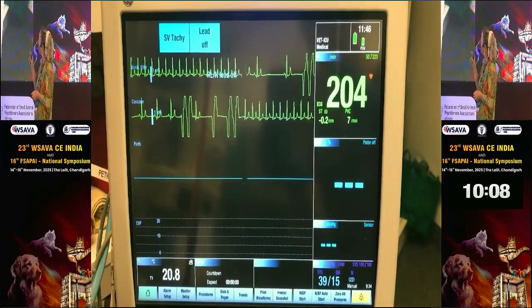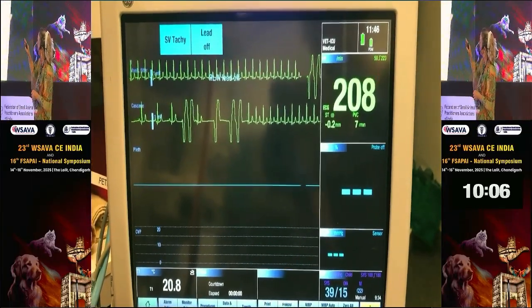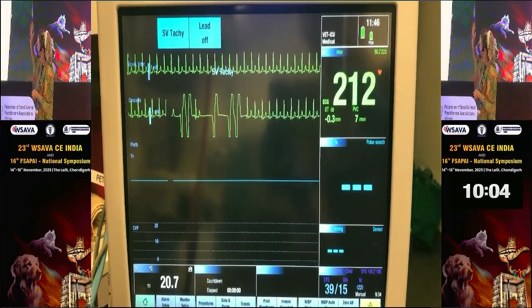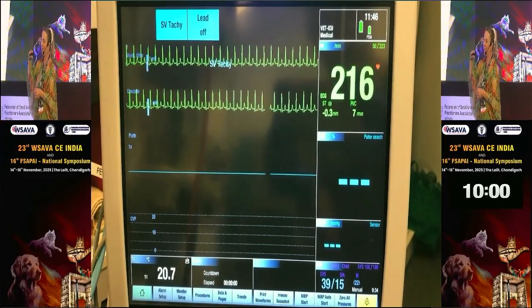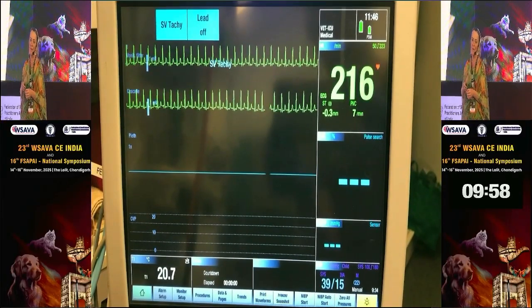Yep. So you can see them intermittently coming through, where you see that M shape where it's just fast down, fast up. If you see that and it doesn't come back to baseline, that's when we would start treating with lignocaine.